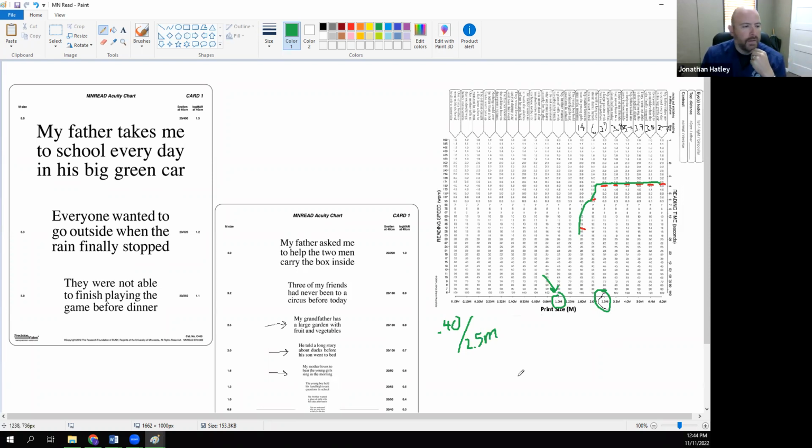All right. Now, in order to determine what kind of add power we would need to give the patient, which is something that the student is required to do on the proficiency, all we're going to do is flip this equation, or flip this visual acuity fraction. And so we would say 2.5, we can leave off the M just for these testing purposes, over 0.4. So let me use my calculator here, which is totally fine for the student to do. 2.5 divided by 0.4 is equal to 6.25.